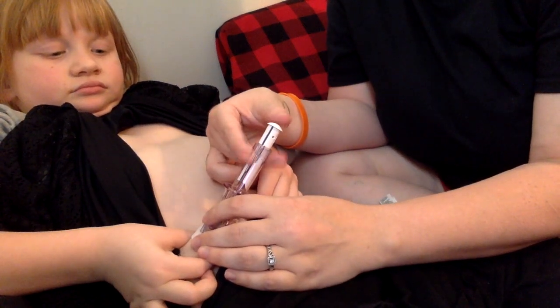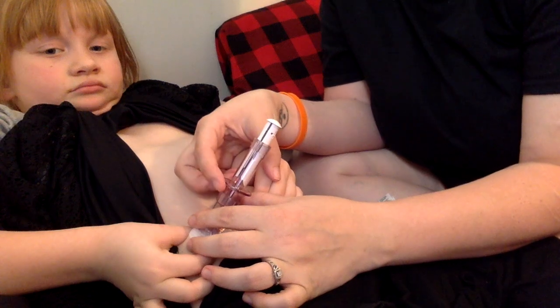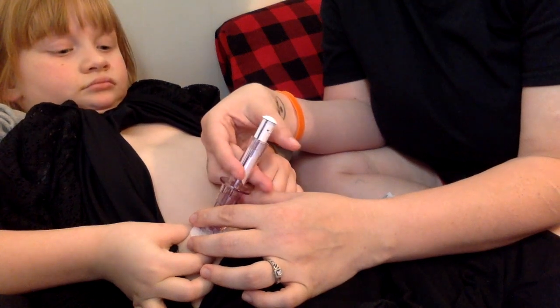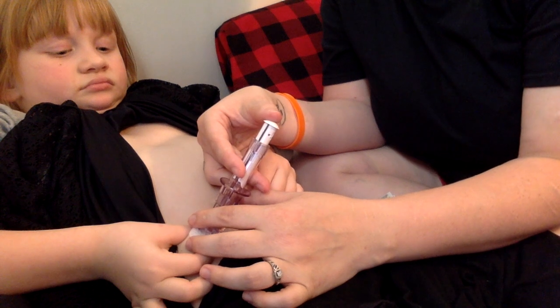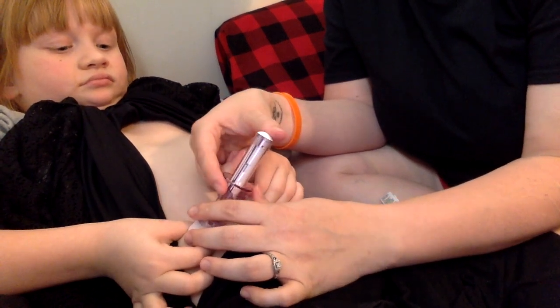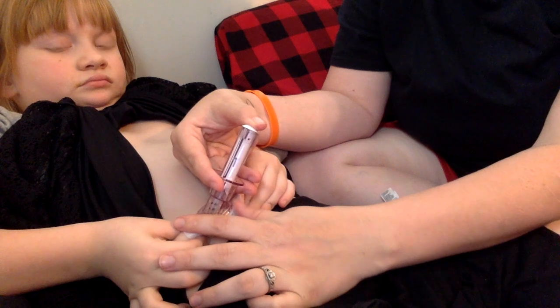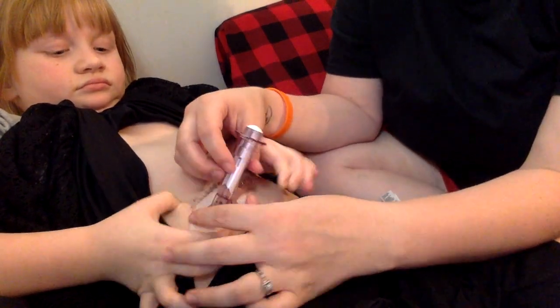Okay. Make sure you don't put your fingers here on this part, because this is the very last thing you're going to pull up. So you want to put your fingers above it right here. Push the white part in. Ready? 1, 2, 3. Until you hear 2 clicks. And then you put your fingers down here, like you would on a syringe, and you pull up again. Ready? 1, 2, 3. Click, click. 2 clicks, and that pulls the needle out.